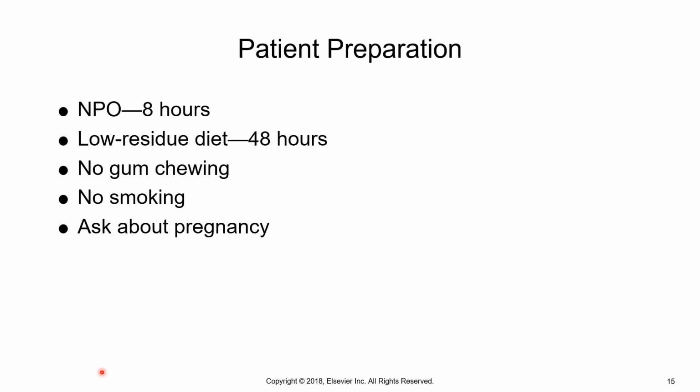They typically follow a low residue diet for about 48 hours, meaning they're told to be careful of what they actually eat. There's no gum chewing, no smoking, and as always, we would ask about pregnancy just to make sure that if the patient were pregnant, we would not move forward with that exam until we were told to do so.